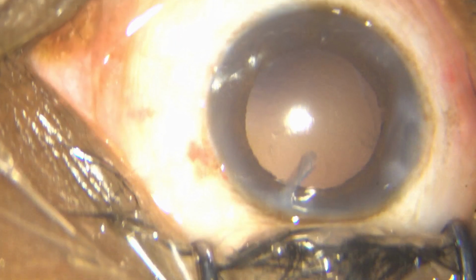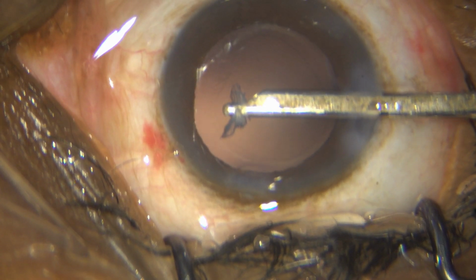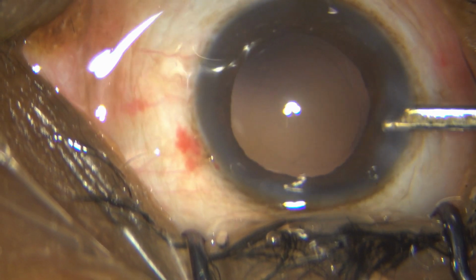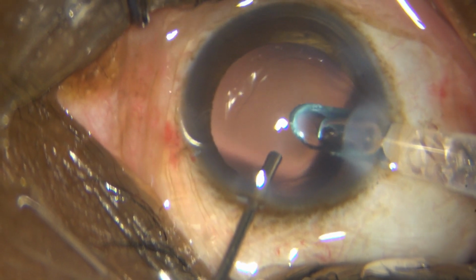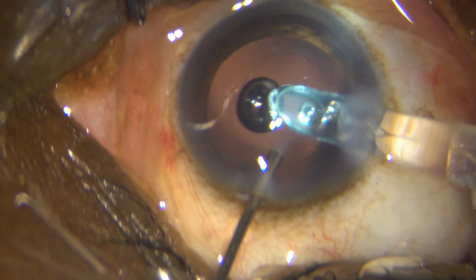So again, I put in, there is a bit of cortex left. I'm not going to try any stunts with that. I just take the good old Simcoe and take it out, and you can see it's done very well. And again, I go in with my endo illuminator just to see how it looks with the IOL going in. This is a safe step. I put in HPMC.